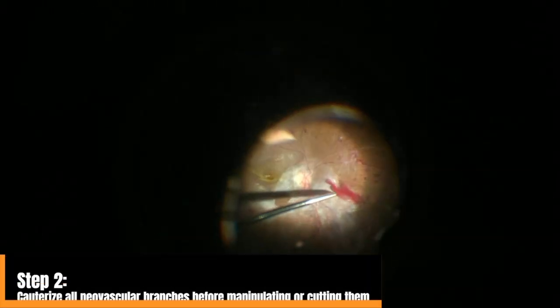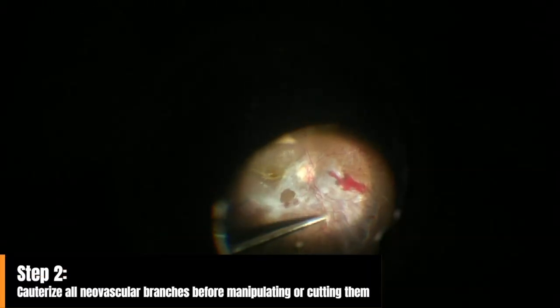Now look at these membranes and how large and prominent these neovessels are. This neovascularization will bleed significantly with the slightest touch, and believe me, it will greatly hinder your visibility for continuing to dissect the membranes. So the next step, never forget, is to cauterize them thoroughly before starting any manipulation.